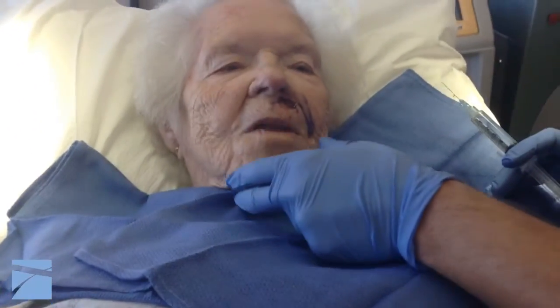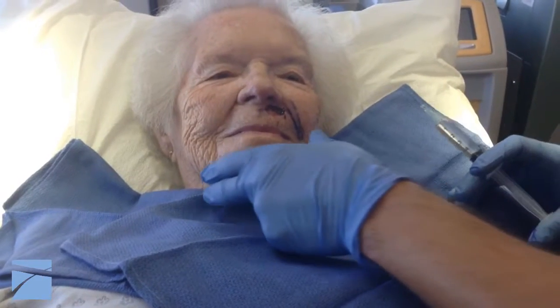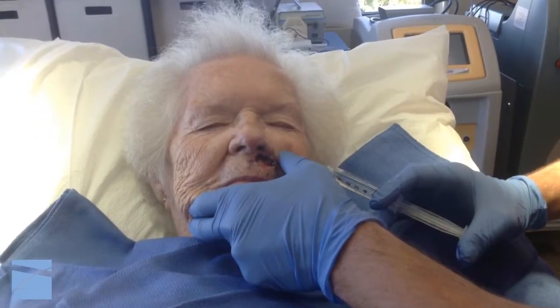Are you ready? No. Okay, we're going to get started. So actually first I'm going to do a little bit of a nerve block because I think that'll be helpful for her.